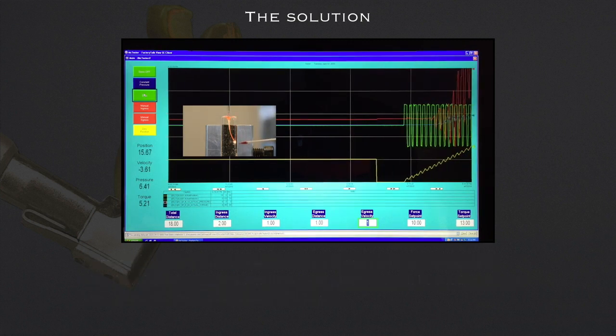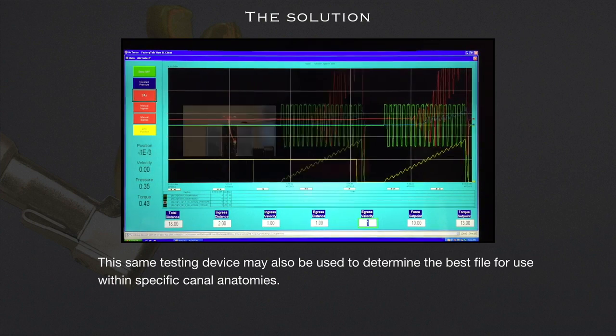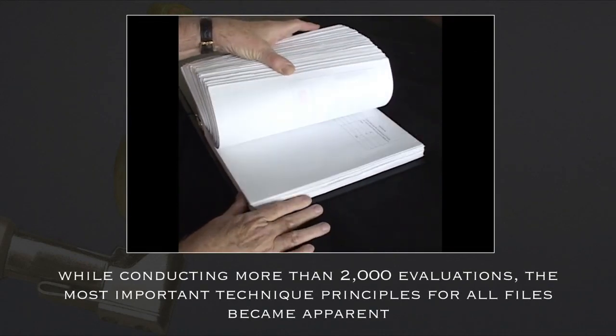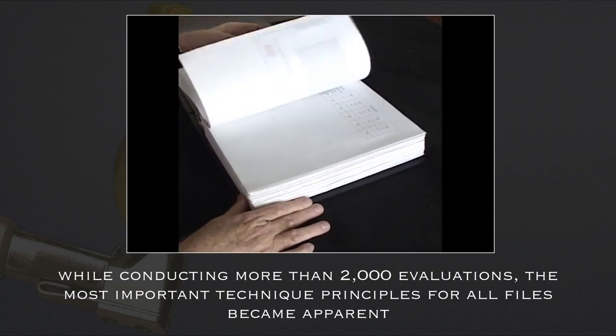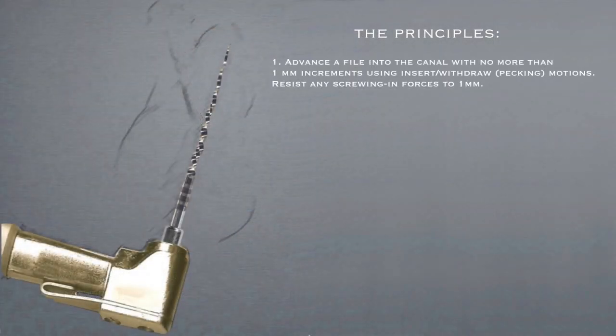This same testing device may also be used to determine the best file for use within specific canal anatomies. While conducting more than 2,000 such evaluations, the most important technique principles for all files became apparent. And what were these principles? Well, first, advance a file into the canal with no more than 1 mm increments using insert-withdraw pecking type motions, and resist any screwing in forces to 1 mm as well.